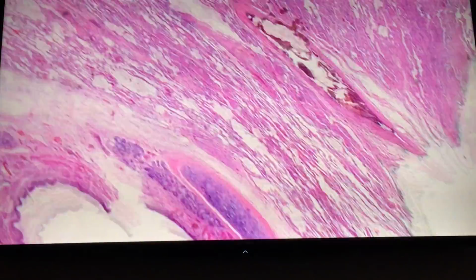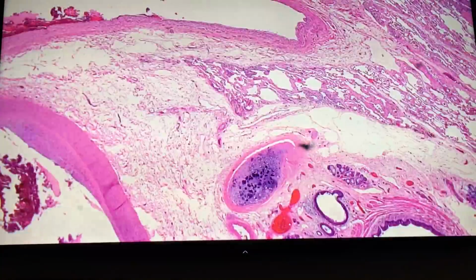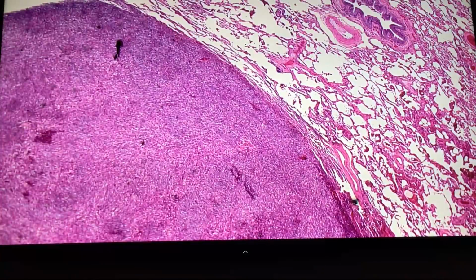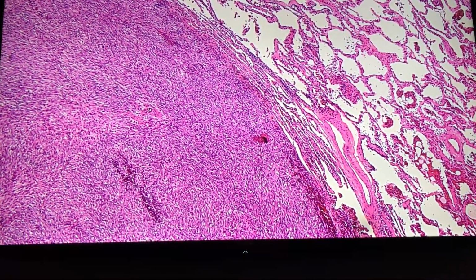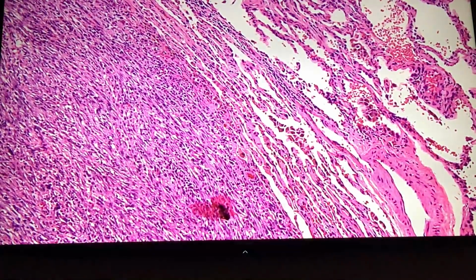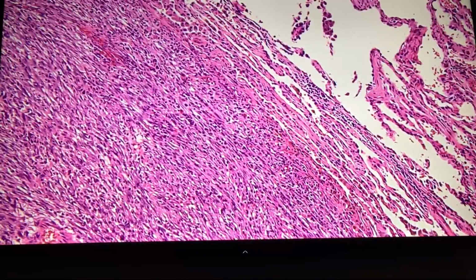So we are back to some kind of resection or big biopsy. Do you want me to slow down, or should we keep at this pace? Fast pace? Okay. I want you to fill in the blanks. The lesion in this case is a dash. Circumscribed. What? Nodule. Nodule, yes. You should start like that. It's a nodule or a mass, and we're trying to explain what that is. Good.